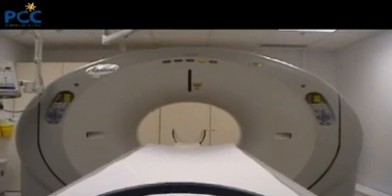Sometimes you give a chemotherapy, you will see that the tumor has shrunken even on a CT scan. You can already know that your chemotherapy is working. But sometimes the size of the tumor may stay the same, but the metabolic activity, in other words, how much FDG it uptakes, actually has gone down to nothing or it has diminished significantly. So the PET scan has the advantage of both telling you structurally, anatomically, whether it has reduced in size, and also metabolically, whether it has shown improvement.